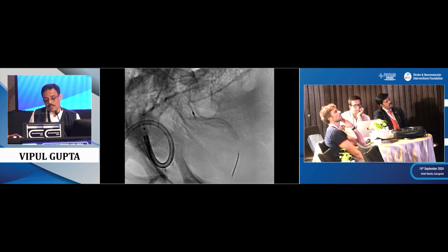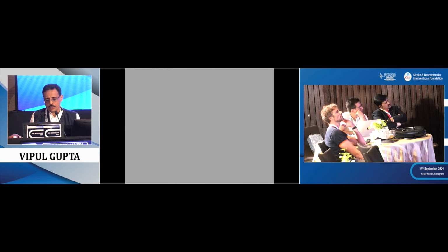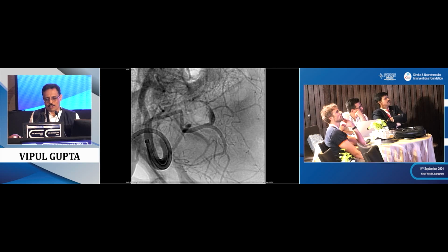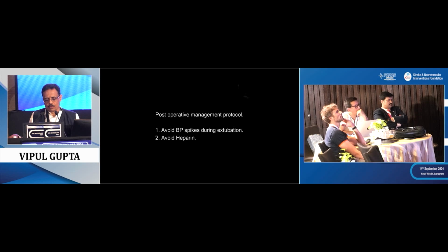She was a young lady, a young doctor, with a huge PICA. So we had decided on preserving it. And this one wasn't as tricky as that one to do. There is some stasis in the aneurysm. We debated whether we wanted to place some coils in there. We thought maybe we'd complicate the procedure too much. There was quite a bit of stasis and flow change immediately.